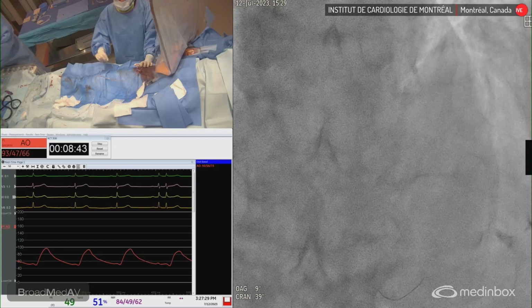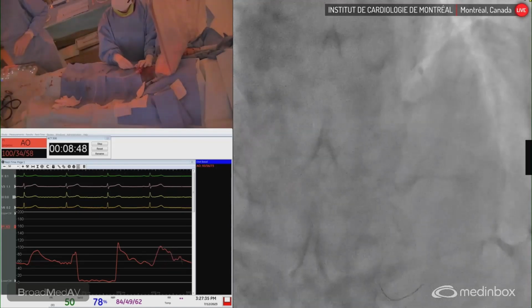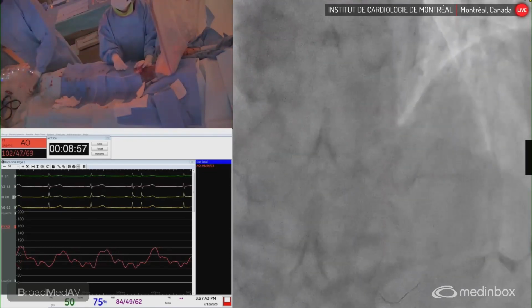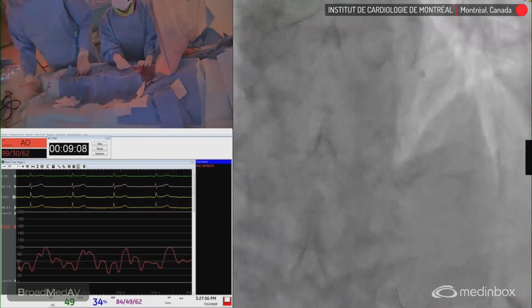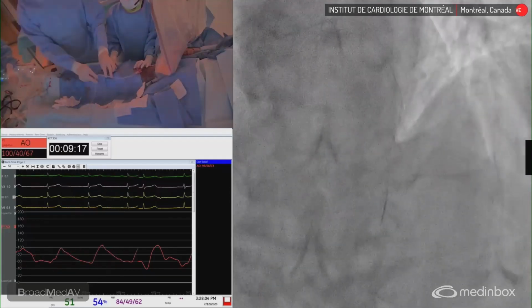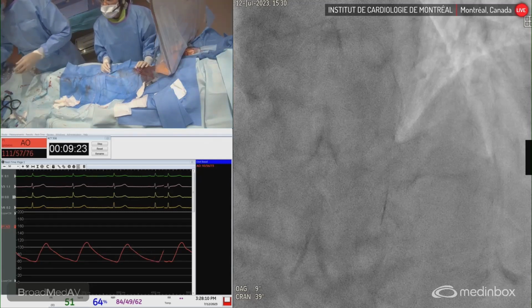3015, s'il te plaît. OK. Vas-y, je l'ai. Jimena is pushing slowly the microcatheter. We had a lot of difficulty actually bringing it in initially, so we'll see whether it goes in nicely. I'm expecting this fully. Quite smooth. So very smooth. Okay, it's fine. So we'll stop there, remove the roto wire, change it for the BMW. Okay, merci.